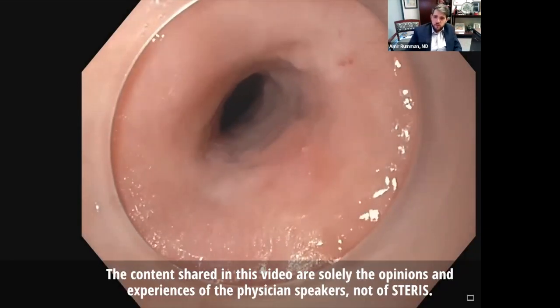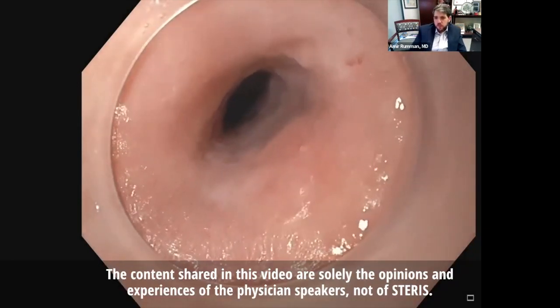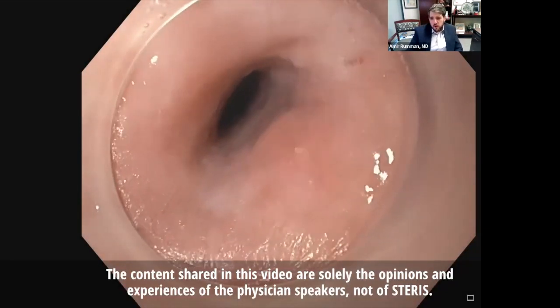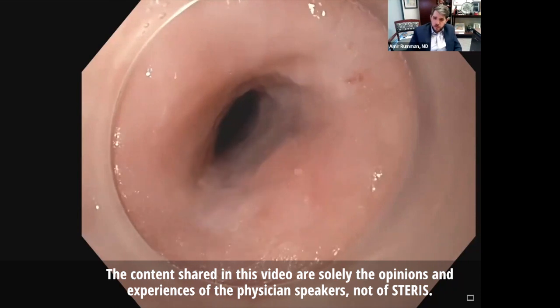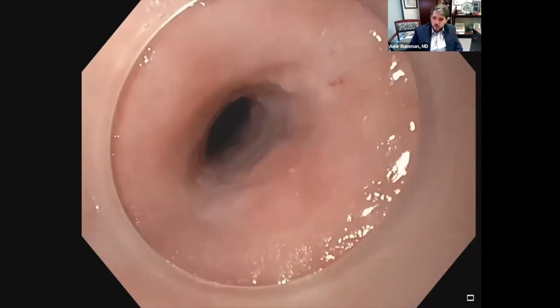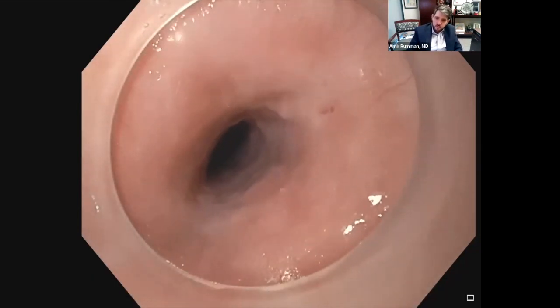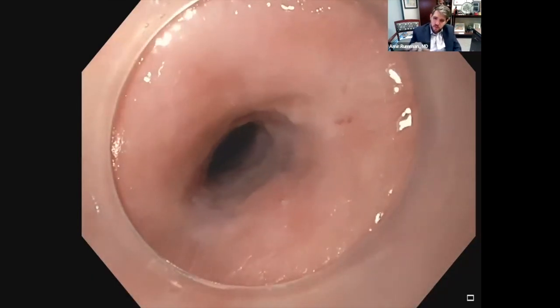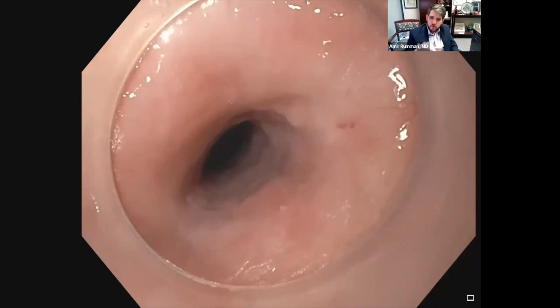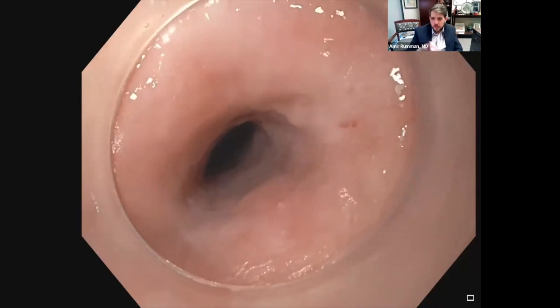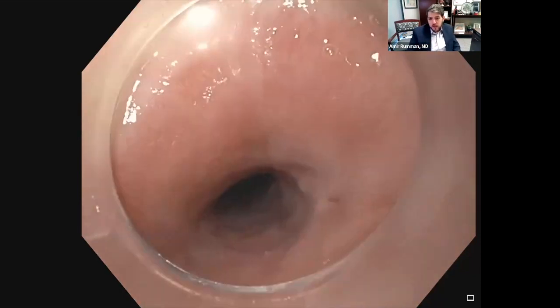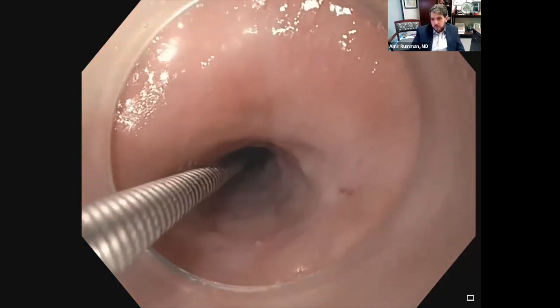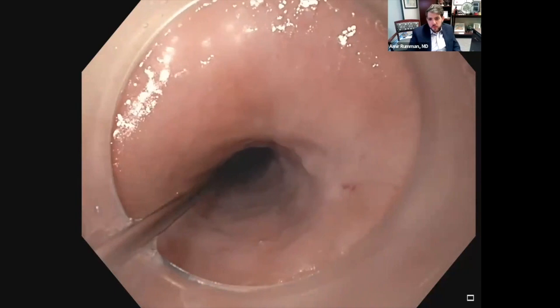This is actually a caustic ingestion. You can see this is a very fibrotic stricture. If you look at the six o'clock position, you can see this whitish hue to the stricture. The inner diameter here is probably around seven or eight millimeters.